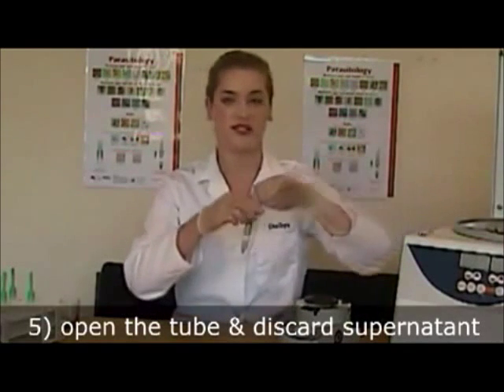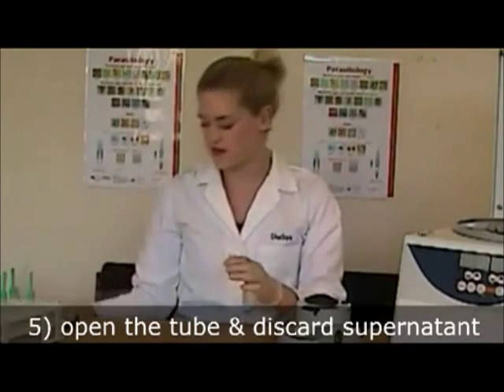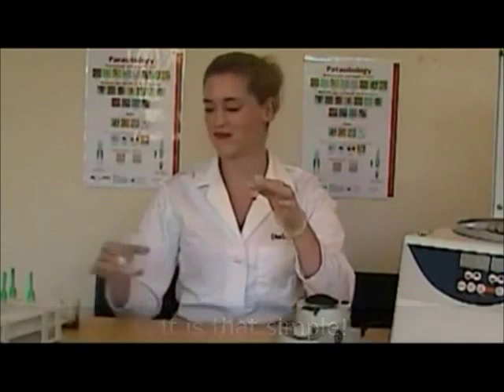After centrifugation the device is simply opened and the waste end is discarded in the safety box. Pour off the excess liquid and you are left with the sediment. It is as simple as that. You are now ready to dispense the sediment column for microscopy. Thank you.